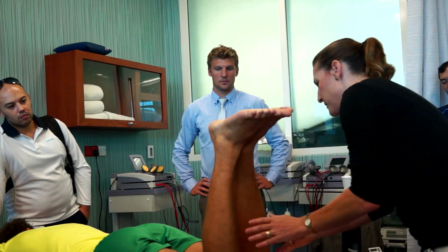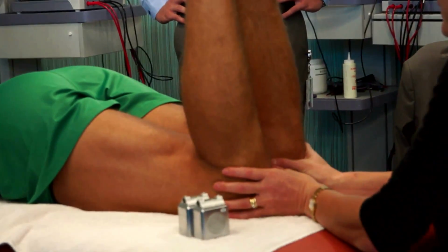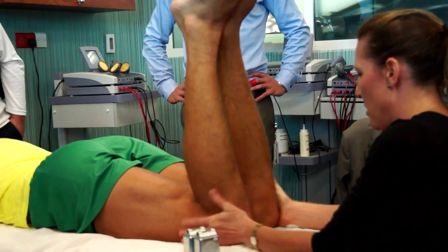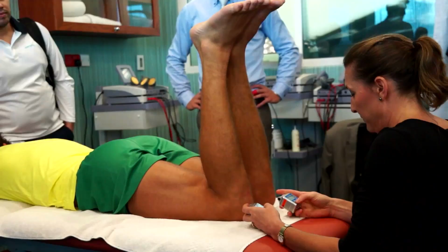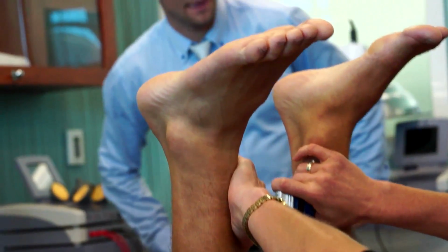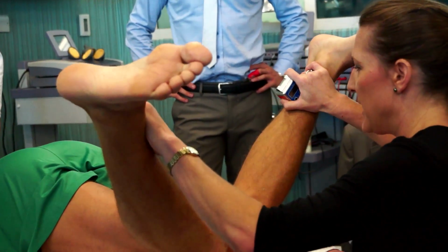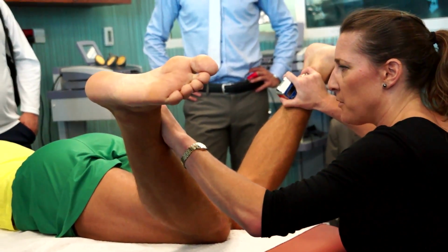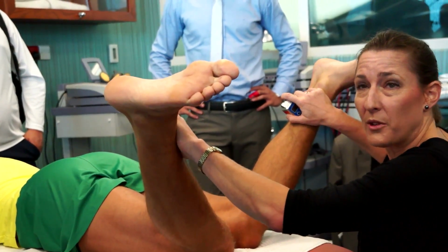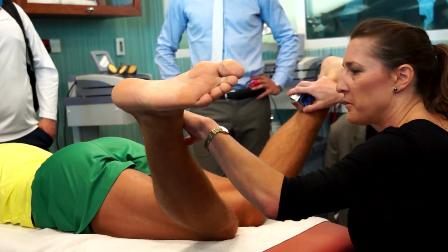Okay, and with this test, it is important to try and have the knees held together, and very commonly the athletes will spread their knees apart as we're doing the test. So try to get them to hold their knees together. Place the digital inclinometers on those medial points and bring them gently out into internal rotation. Relax. And the same thing as we talked about with the bent knee fallout, this gentle overpressure. So you're not reefing them to full end of range, but just where their tone stops and we get that little bit of a block.